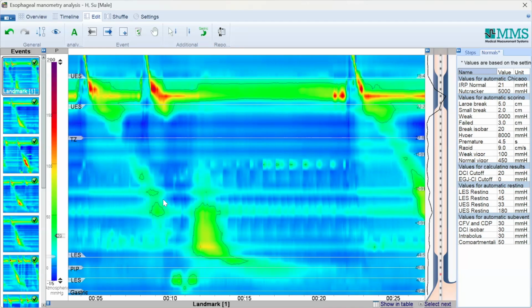Let me pause you for a second here, Basil, and let's rewind a little bit. Let's say the patient is sitting on the bed, and you bring that catheter that you have calibrated, and it is all ready to go. The way you do it, do you usually put some local anesthesia in the nose, or some gel on it, or what do you do? How do you insert it?